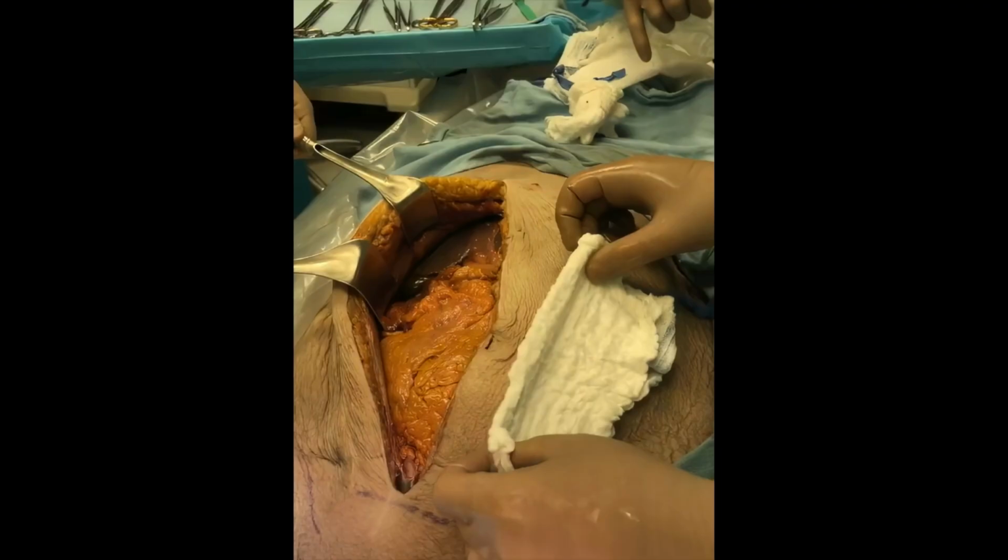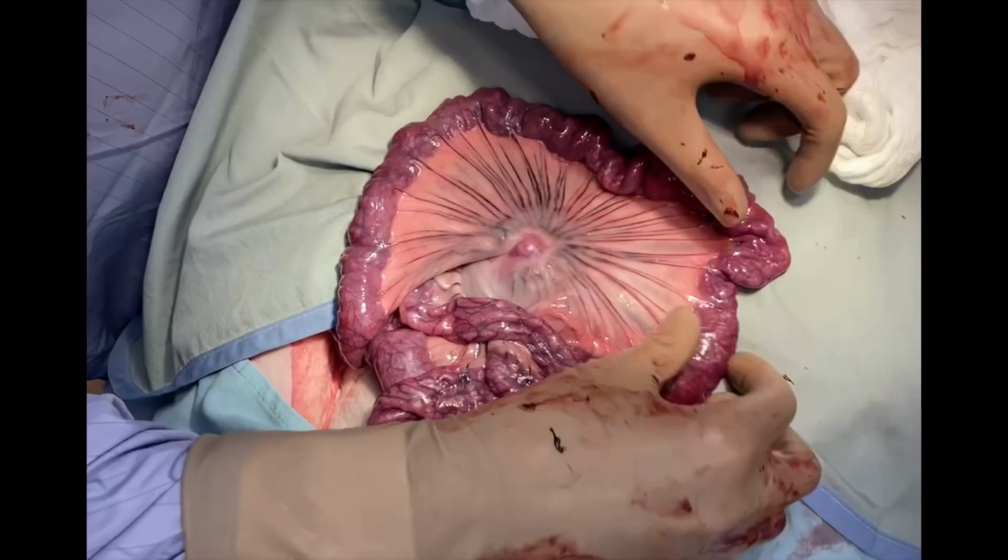To begin, make a vertical midline incision and explore the abdomen to identify the area for resection. This area should minimize margins in order to preserve as much length of viable bowel as possible. Isolate the operative field as best you can by adding extra sterile towels to avoid contamination of the abdominal cavity with spillage.